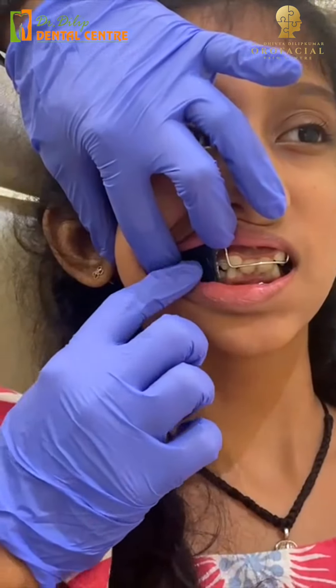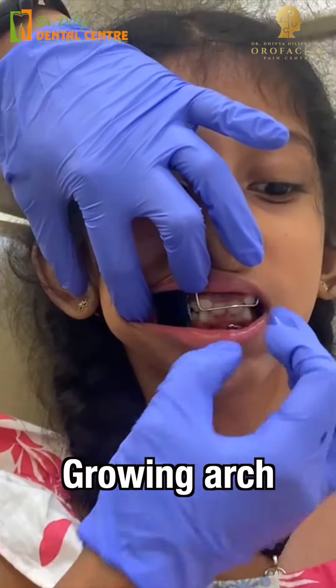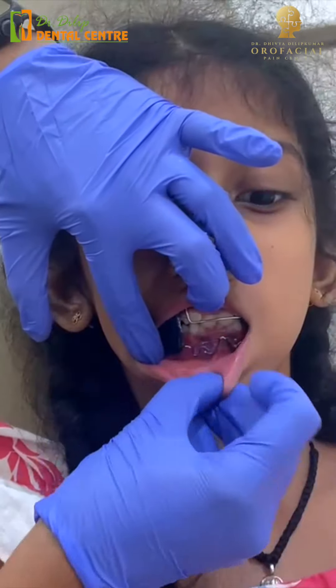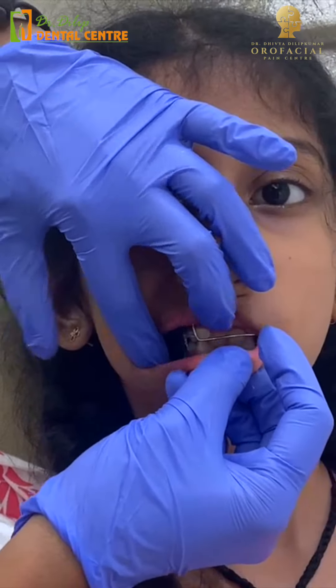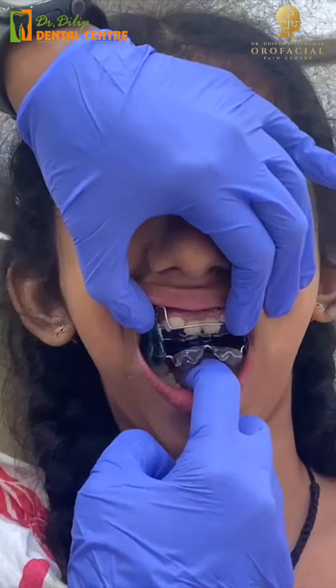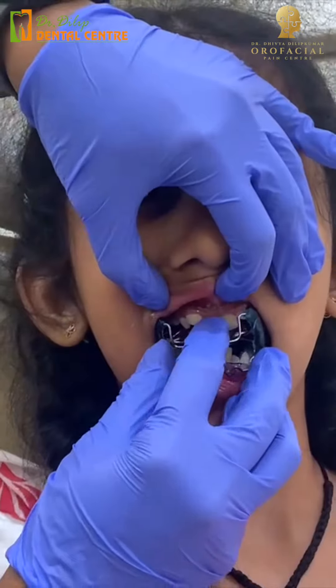Here is a buccal shield — the cheek pressure will cause growth, so the arch will grow. Here is a wire, and the two sides will grow. The lingual shield and pads will cause bone growth. If you pull it, it will cause bone growth. If you look at the pad, it will cause bone growth. And here are two small springs, so here are two sides.